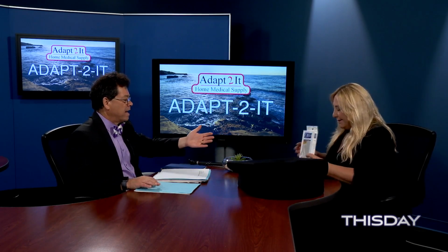Very good. Now we are going to talk about these stockings. So tell us what they are exactly. Okay, so here are what are called anti-embolism stockings. Let me go like this, just so we can give you a little room here. These are anti-embolism stockings. These are the old-fashioned white stockings, not really old-fashioned. These are the white stockings that you get in the hospital.